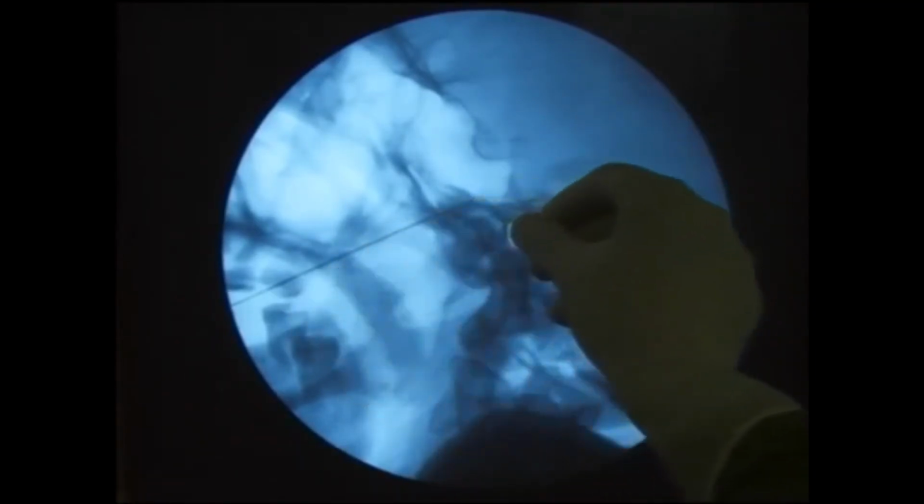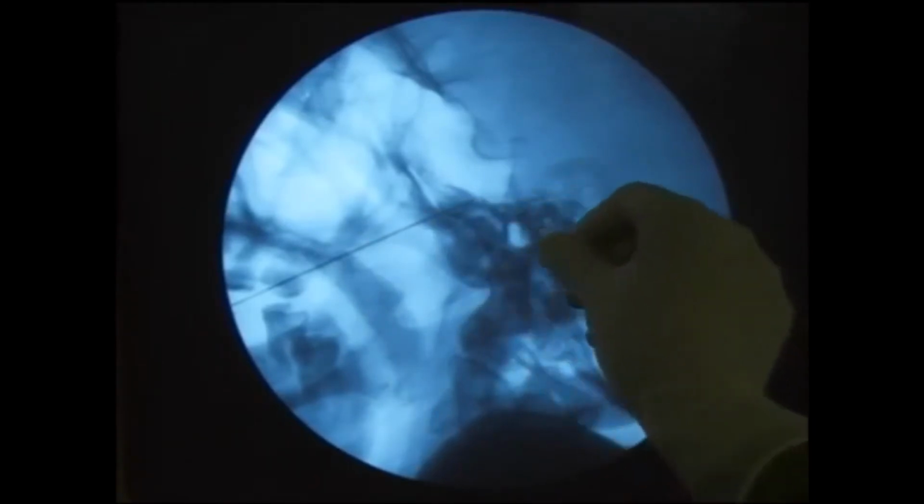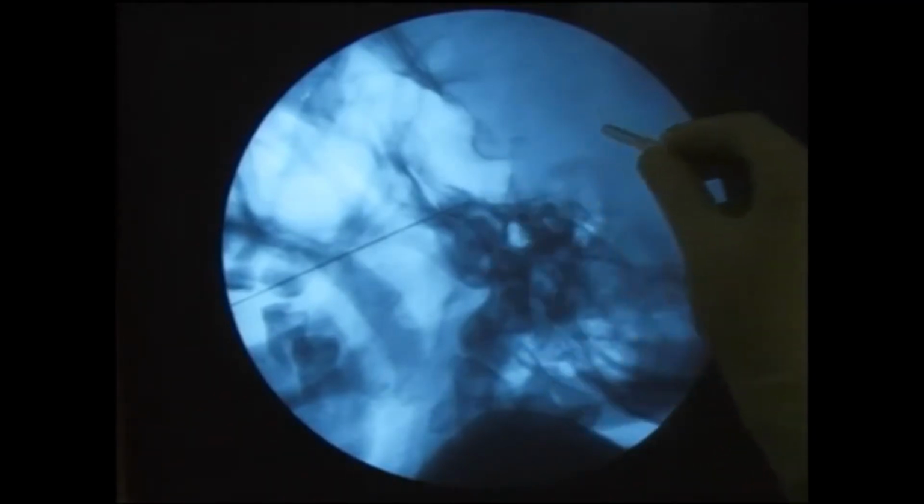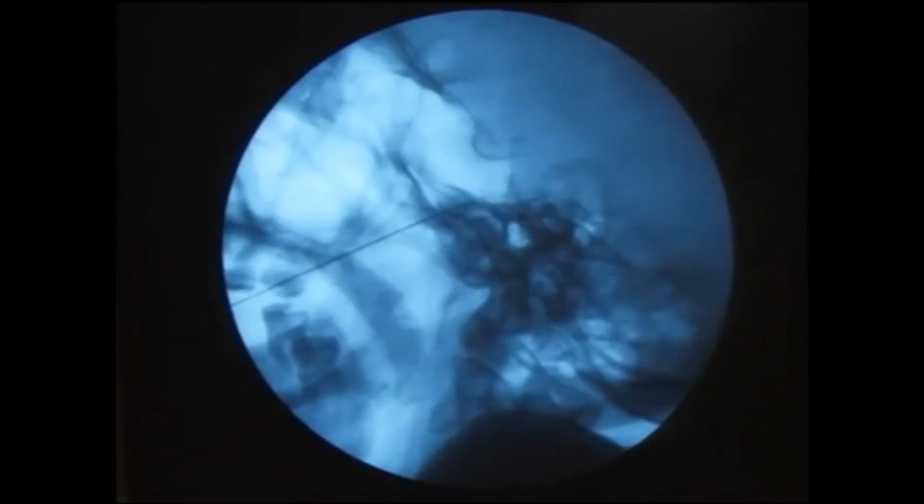So this needle is more or less corresponding to that, and also it's about 3 centimeters anterior to the external auditory meatus itself. So I'm pretty happy with this image. So probably I'll go in a little bit more inside. I want to be here somewhere and then start a bit of stimulation. Hopefully I won't get too deep into the dural sleeve itself and get some CSF. Okay. So right now the plan is to go a little bit more deeper.